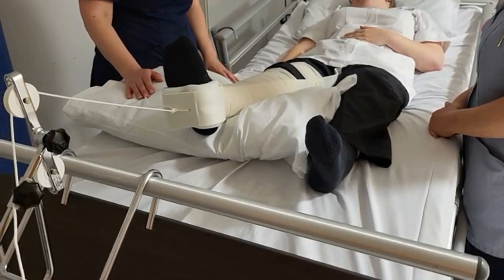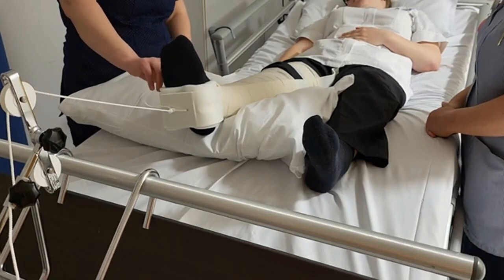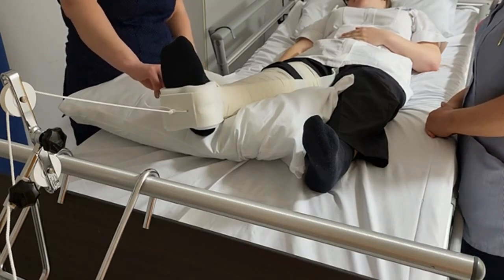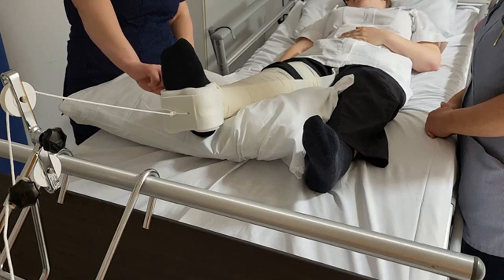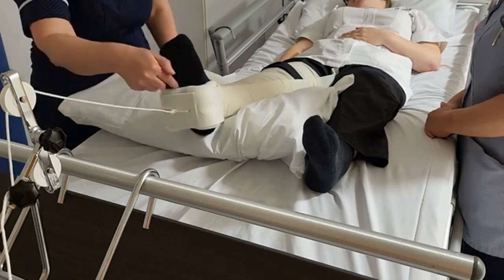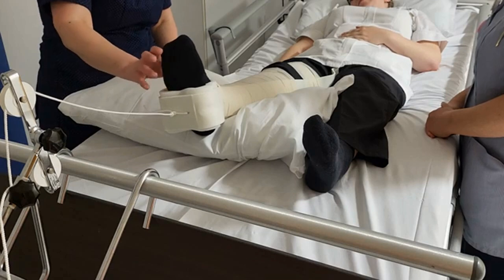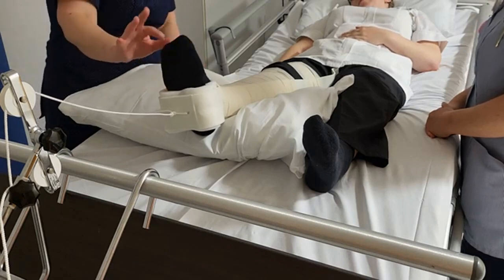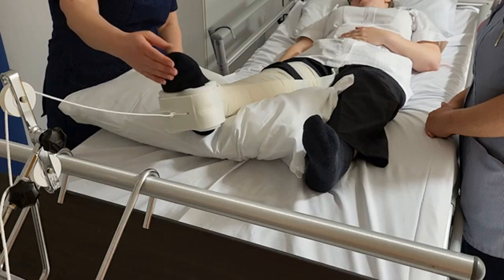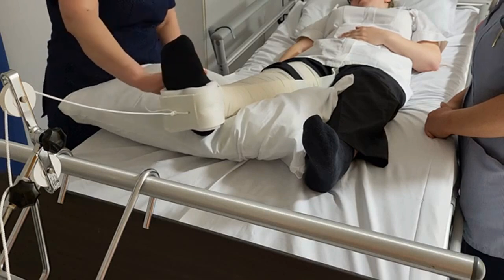Ongoing cares for the child in traction: neurovascular observations need to be done initially for the first five minutes post-application, then at half an hour, and then hourly after that. We need to feel for the pedal pulse found in the foot, and check the colour, warmth, and circulation. We check that she has full feeling in all her toes, her heel, and across the top of her foot. We also want her to wiggle her toes, point her toes, and bring her ankle up. These observations are done every hour.